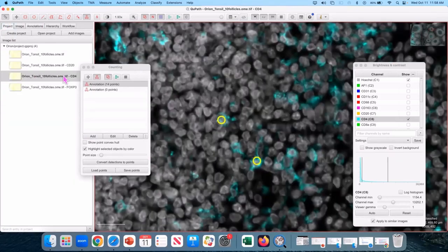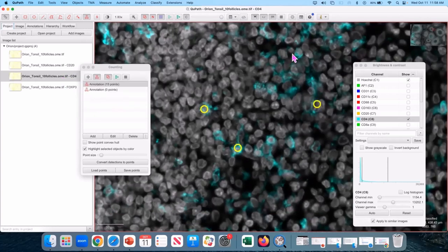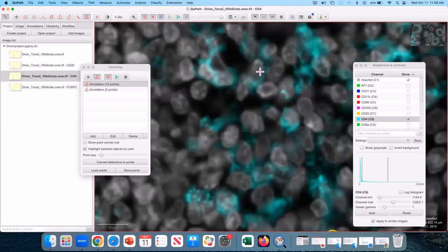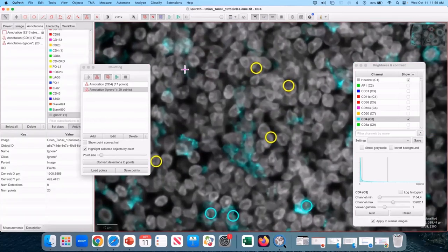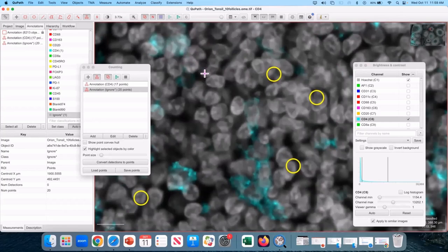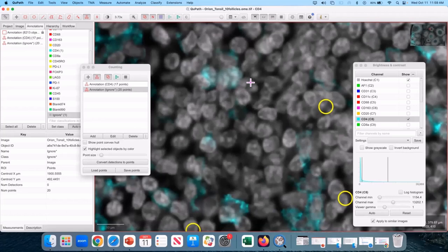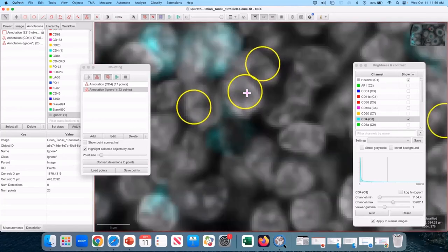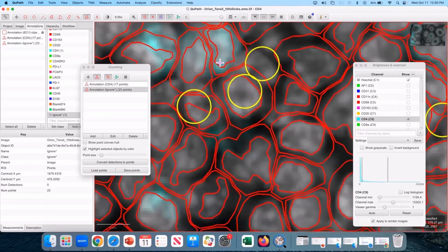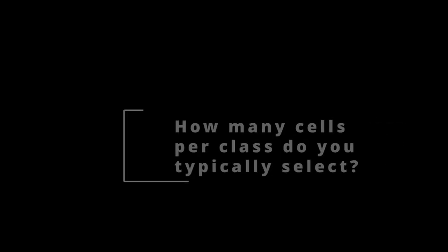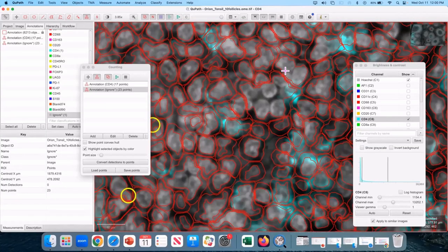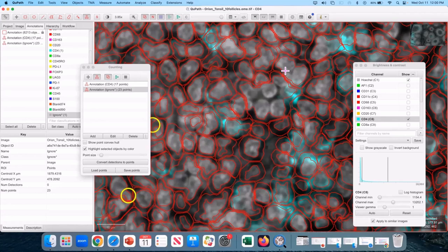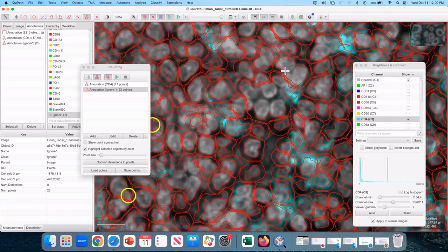I'm in the image labeled, like pre-labeled CD4. That way it's very easy to go back to your CD20 image and correct your classifier if you want to. It should be either CD4 or ignore. If you are interested in making a good classifier, one of the things that I find helpful is for marking your negative cells, make a point of marking cells that are next to positive ones, because they will have just a tiny little bit of CD4 in the membrane. And you want to specifically train QuPath that this tiny little bit. If you only ever annotate the clean ones, it's easy.